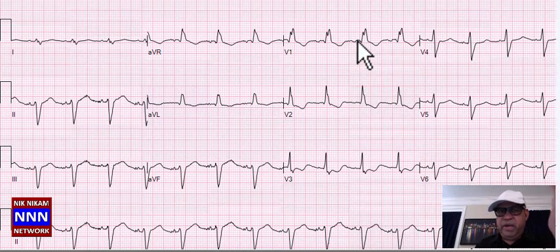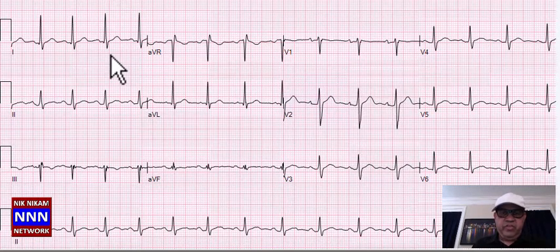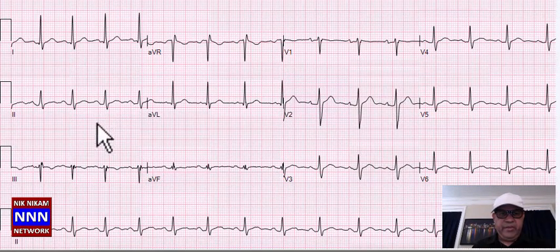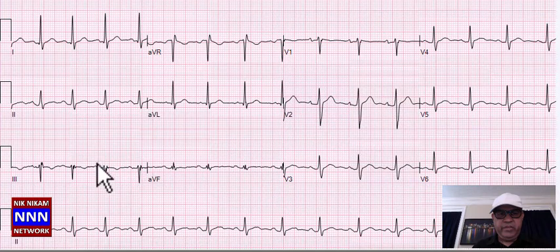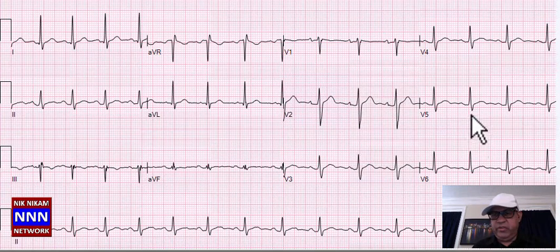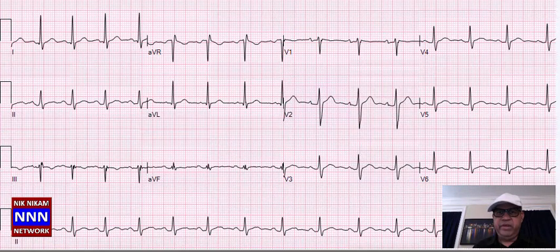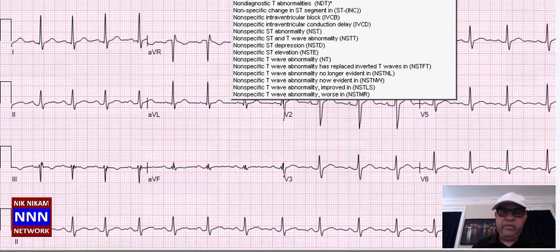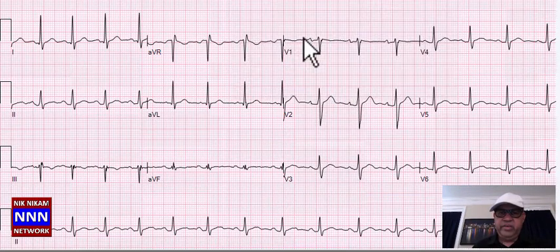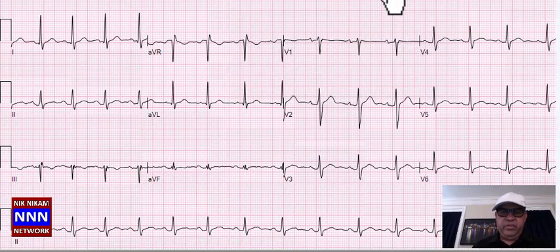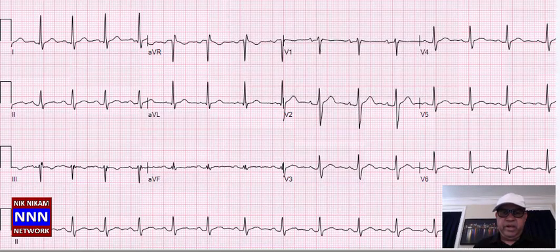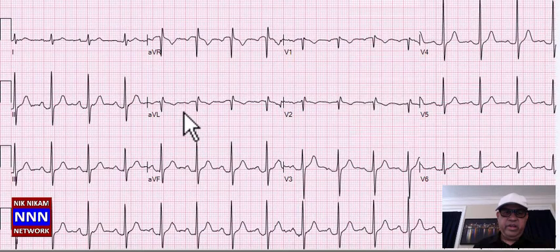If the PR interval is prolonged, it becomes trifascicular block, but here the PR is normal, so we are dealing with bifascicular block. We have sinus rhythm, inferior wall some ST-T changes, lateral wall some non-specific T-wave changes — basically non-specific ST-T changes, no evidence of old infarctions or arrhythmias.